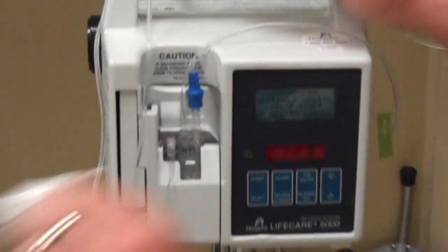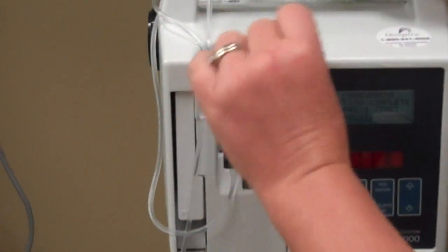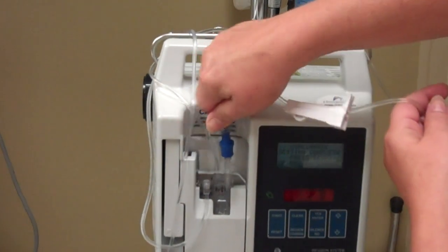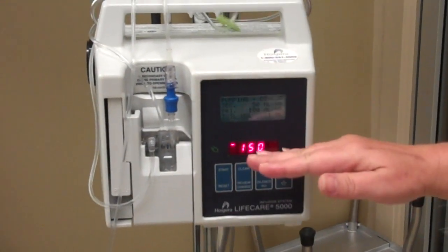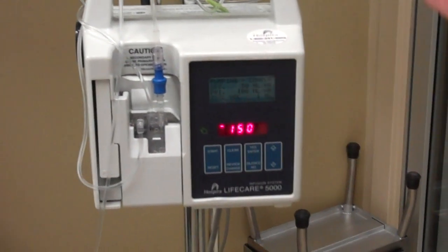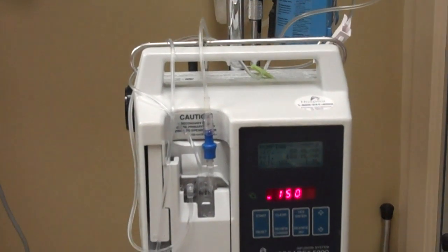At this point, get your alcohol pad and wipe off this cap — the port closest to the bag on the Plum pump, which is actually in the pump. Wipe it off, take the cap off, screw it in here, open your roller clamp, and hit start. You should see the rate of 100 — that's the primary — and the rate of 50 — that's the secondary infusing together. So the combined rate is 150.